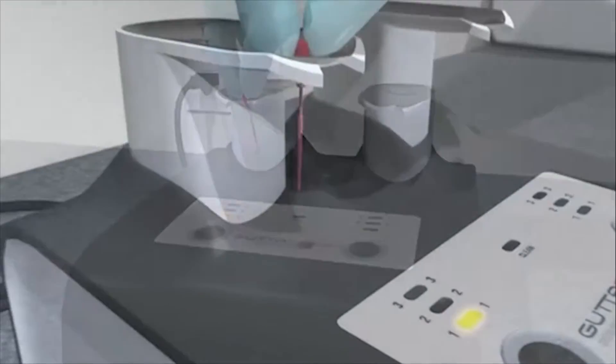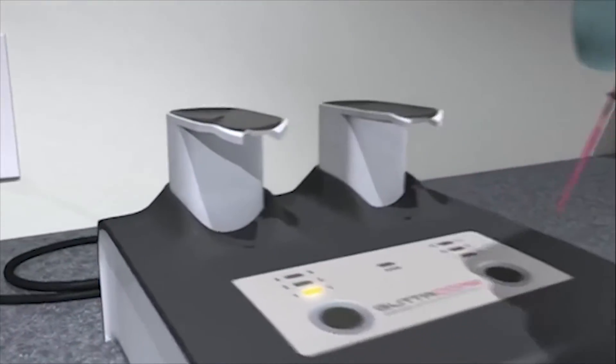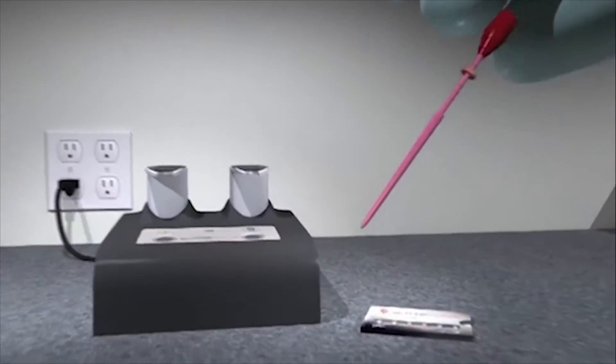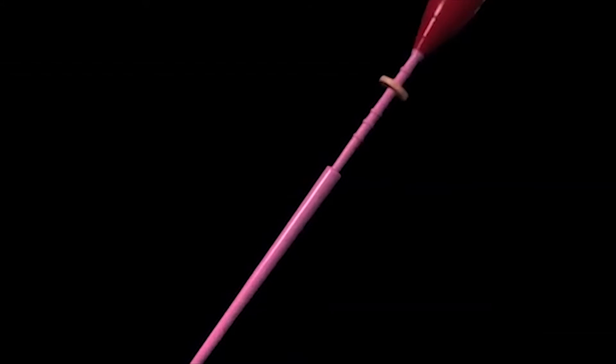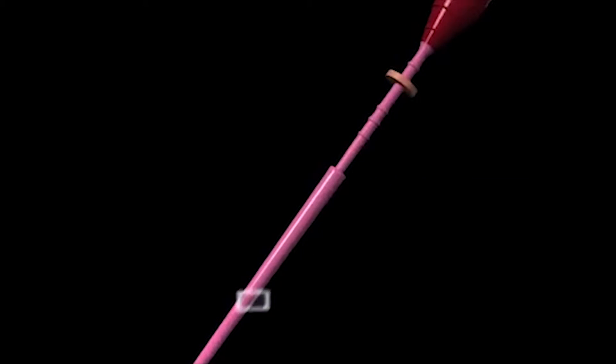GuttaCore obturators are coated with the same flowable alpha-phase gutta-percha that's provided predictable fills for more than 20 years. But GuttaCore is changing obturation from the inside out.